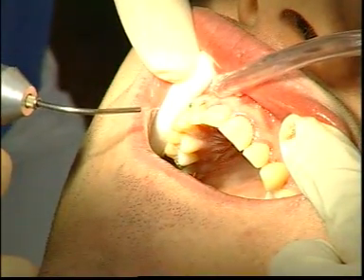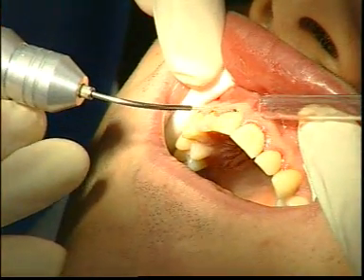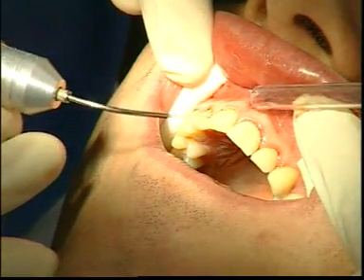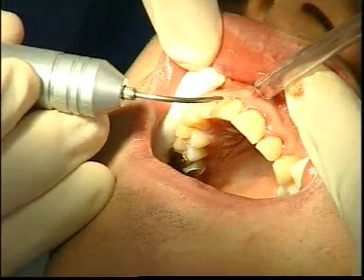The 600 micrometer fiber is directed into the infected periodontal pockets parallel to the axis of the tooth. Superficial de-epithelialization is carried out with continuous quick movements. Marked decontamination takes place.